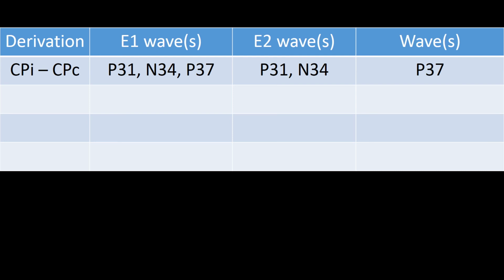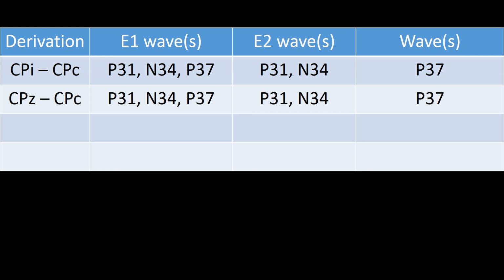This location should be referred to the contralateral centroparietal region in order to get the isolated P37. Yet at times, isolated P37 is found in the midline centroparietal region, referred to the contralateral parietal region.